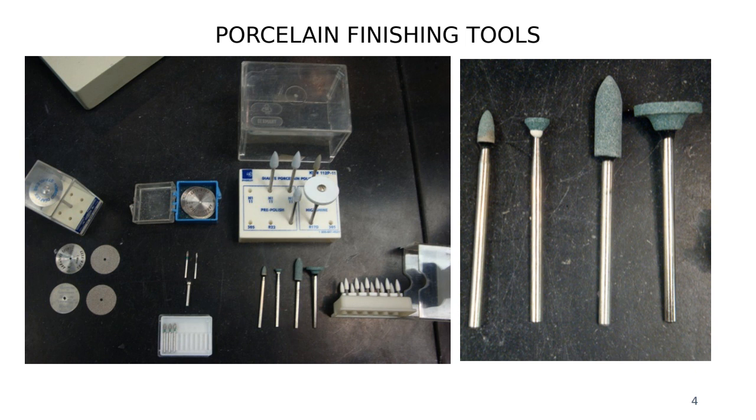There are different burrs, so you have to learn which one gives you that advantage. So to redefine anatomy like grooves, you use a sharper edge burr to get the gap between the grooves. Yeah, that's why I said, for redefining the anatomy, like the grooves and stuff like this, I will use a very sharp, new burr.